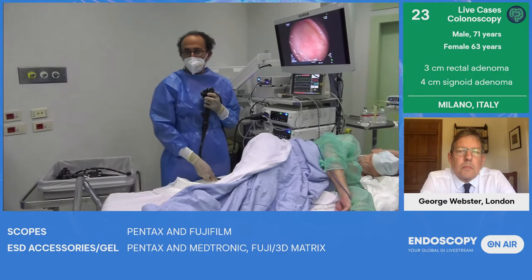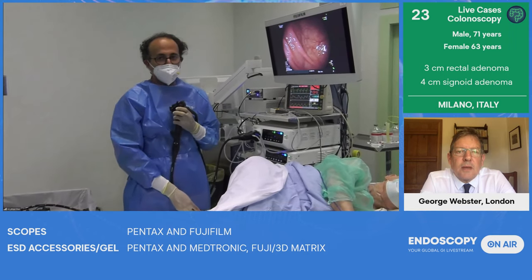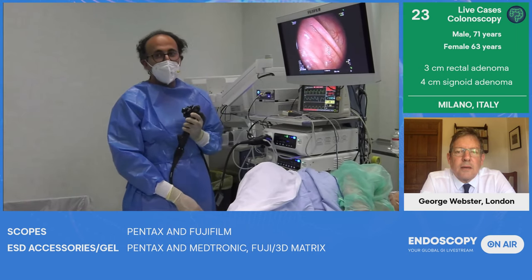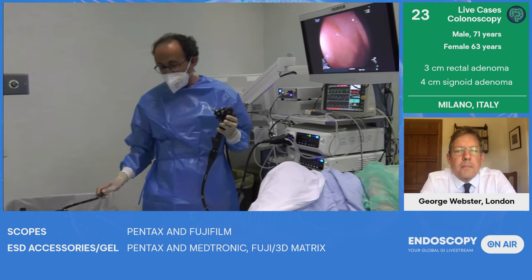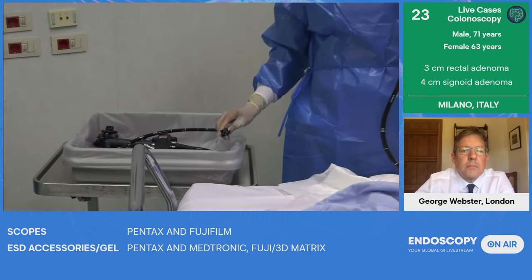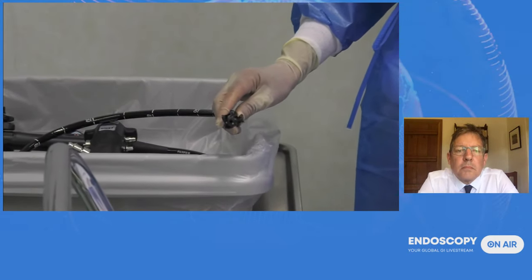Okay. Hey, good morning. Thanks, Ale, for this invitation. We are here with this screening procedure with a very dedicated scope. You may recognize what looks like an Eluxeo 760, yeah. But this scope has a balloon, can you please hear that is helpful to flatten the fold? You know that to flatten the fold is one of the most important criteria for mucosa inspection.